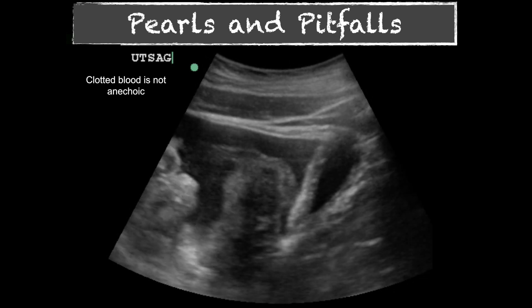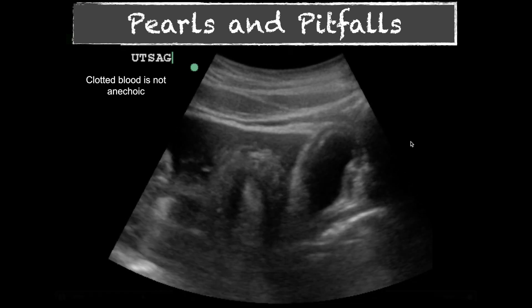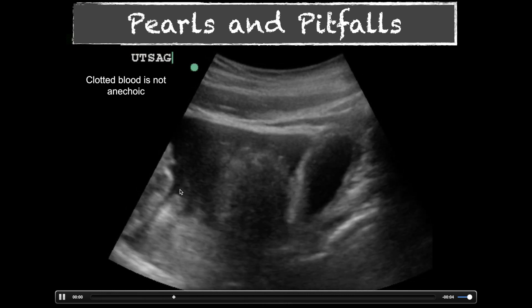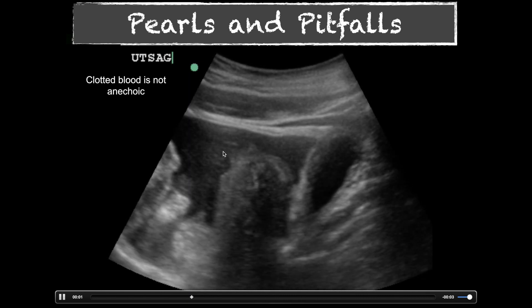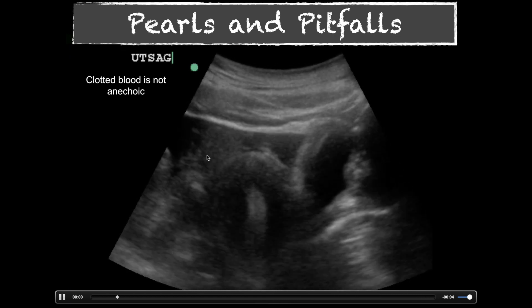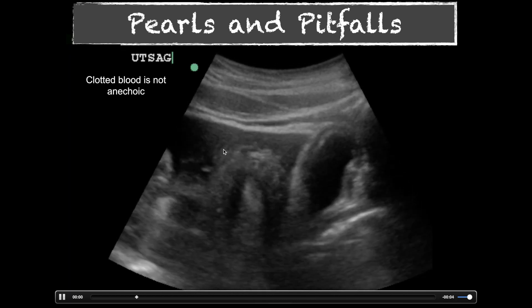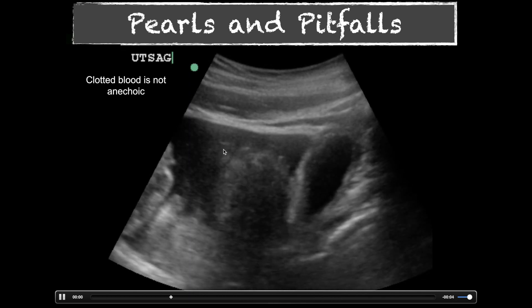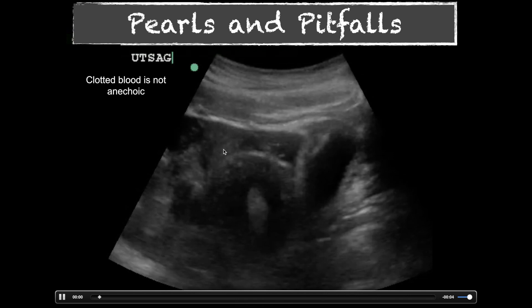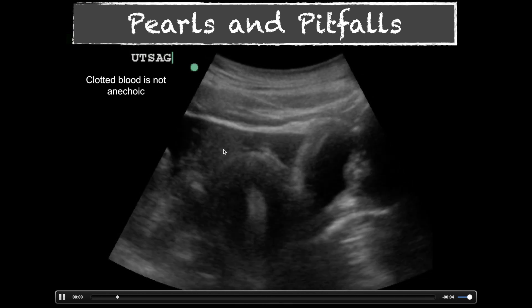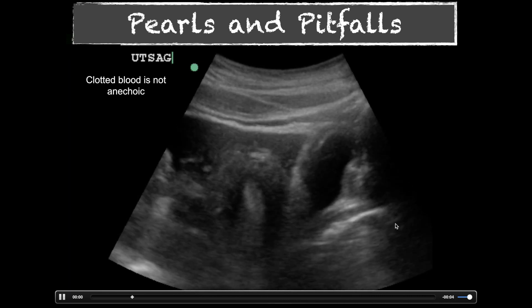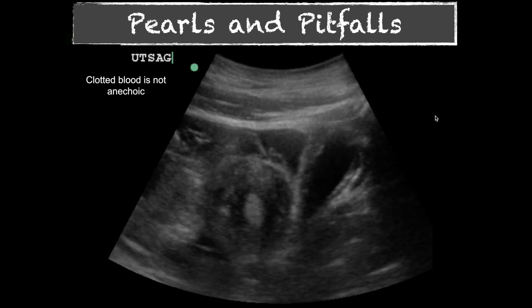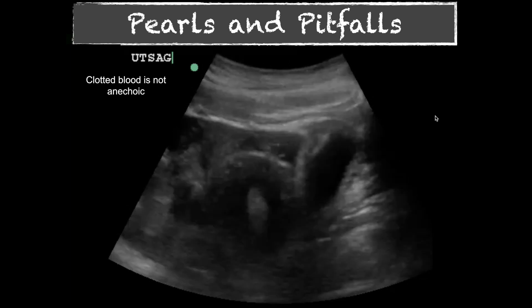In this female patient, we can see the bladder and uterus with the endometrial stripe. There's a large anechoic area but with internal echoes within it. When you see internal echoes within what would otherwise look like free fluid, that is typically clotted blood. Clotted blood may not look fully anechoic — it can appear somewhat isoechoic as it organizes. Pay close attention, because clotted blood may be missed if you're only looking for purely anechoic fluid.